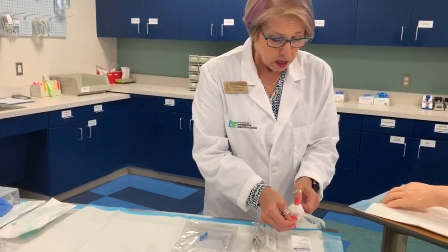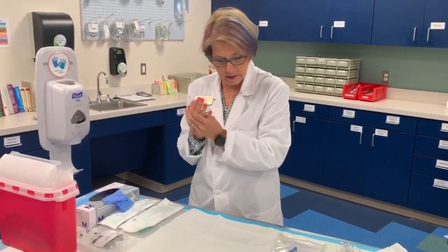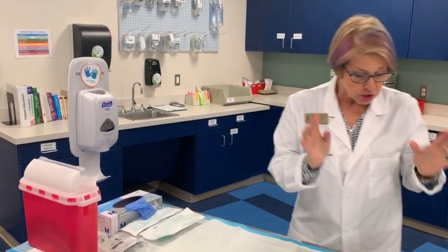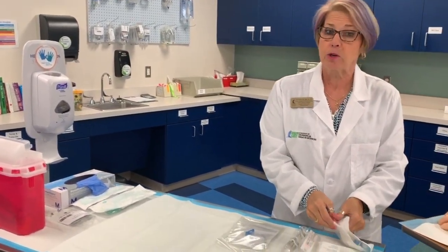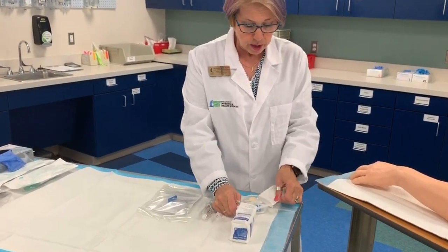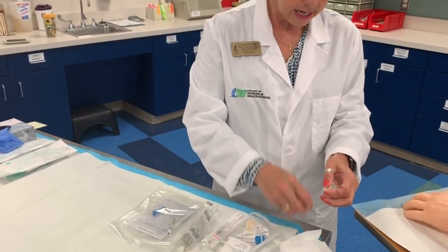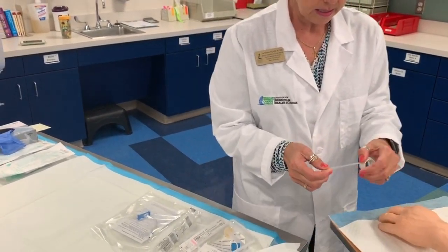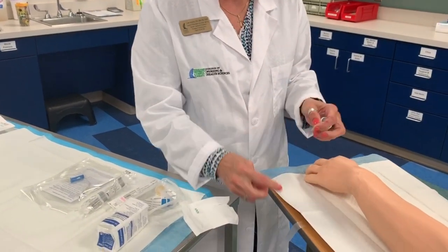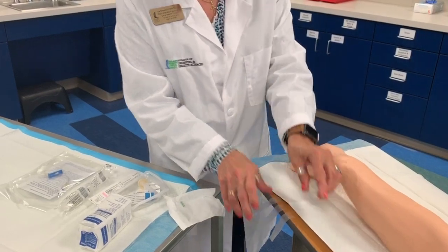So we want to first perform our hand hygiene and make sure that we get our hands nice and clean. And when you get your supplies together, you really don't need to wear gloves here because this is just getting everything ready. So in our IV start kit, you're going to have some tape. And I like to tear off 3 pieces that I will need, and I get them ready close, and I usually use the patient's bed rail or the side table, something that makes it nice and convenient for me.